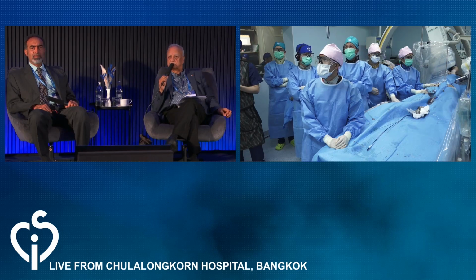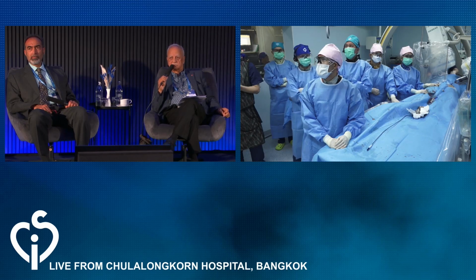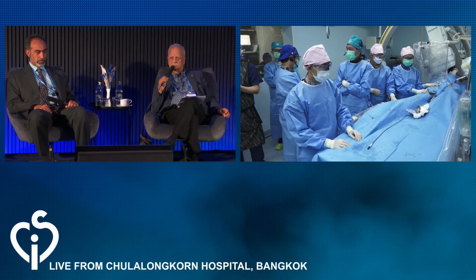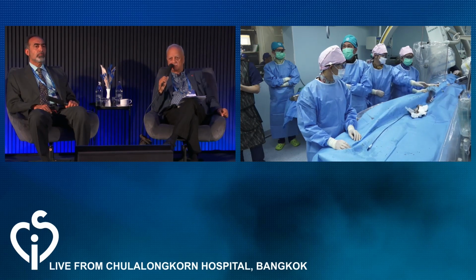Yeah, Nick? This is why I would go for an Occlutech perimembranous VSD occluder, which is flatter and is used for a high pressure difference between the left and right ventricle, and the disc is not too big compared to the filling of the hole.